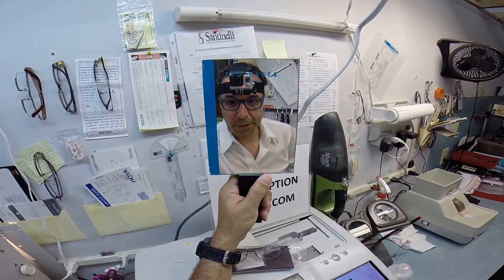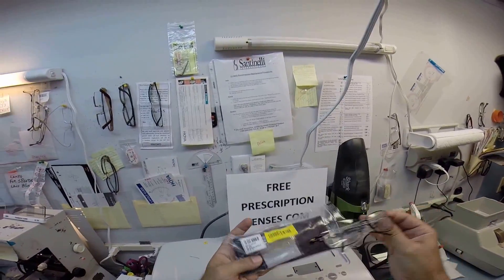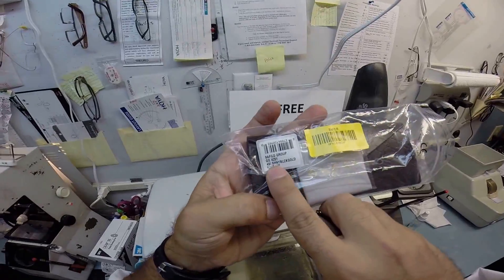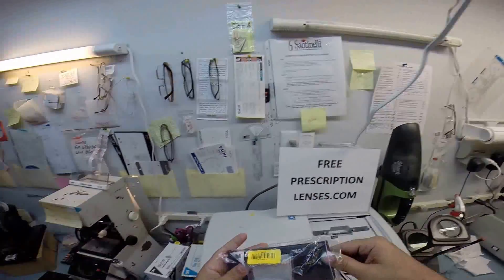Hey Ms. Darren, this is Matthew with FreePrescriptionLenses.com and I'm going to show you how I cut prescription lenses for your new Gucci model number 4251. The color is 4SI, which is the shiny black. So let me begin.